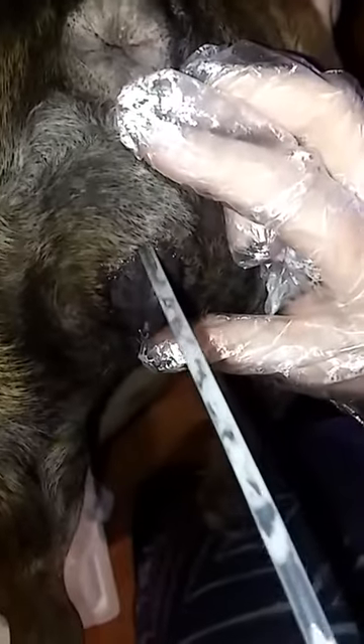Put your finger over the tube, fill this full of air just like that, and attach it back. You're going to want to push this air in as you pull it out so it's not going to come out, and that way it's pushing it all the way down into the cervix.